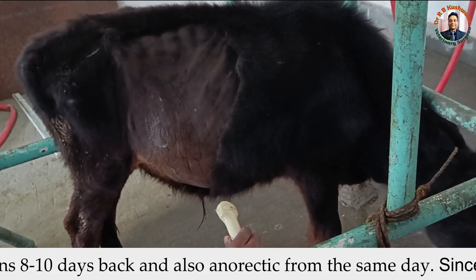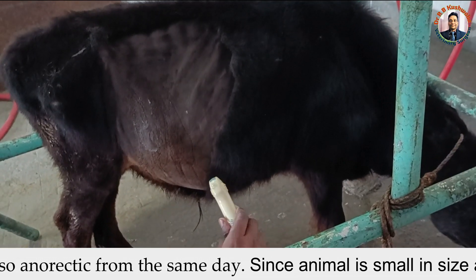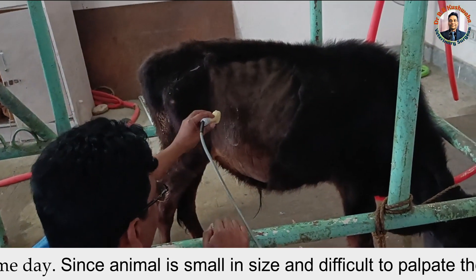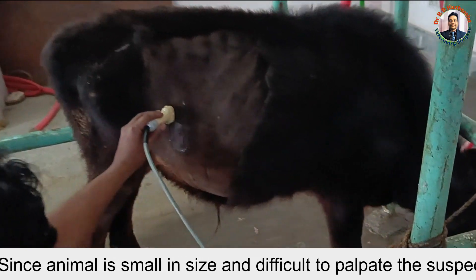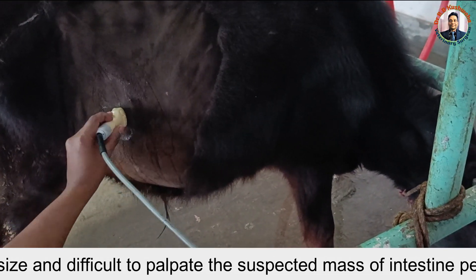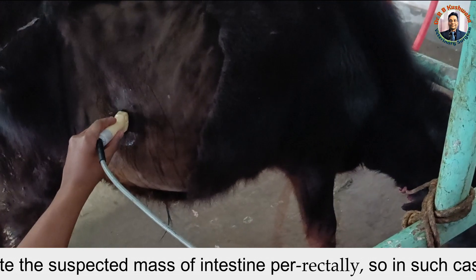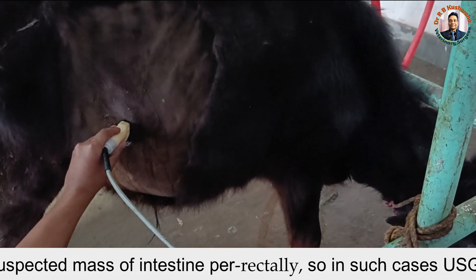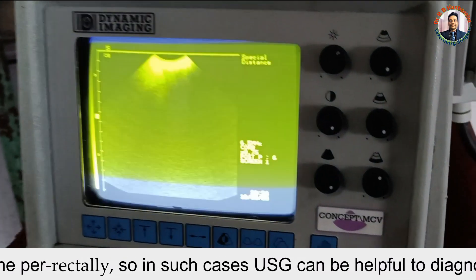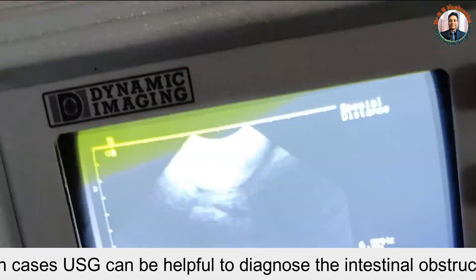In such cases, we can take the help of the ultrasonometer. When we perform the ultrasound, we scan the right flank area and then scan the intestine. What happens in a case of intussusception is that we find distended loops of intestine.